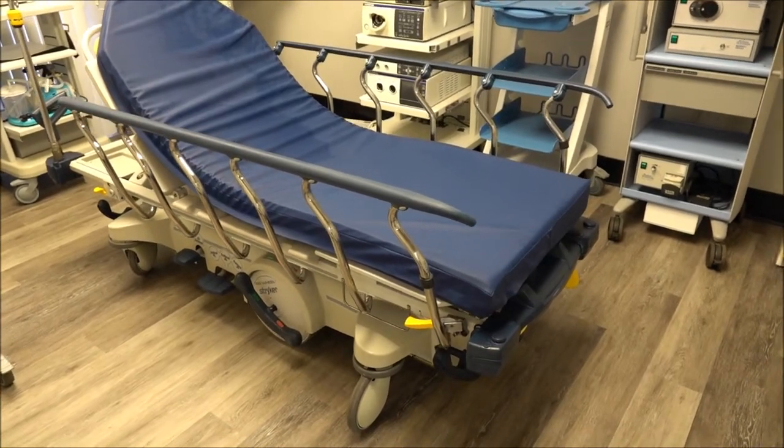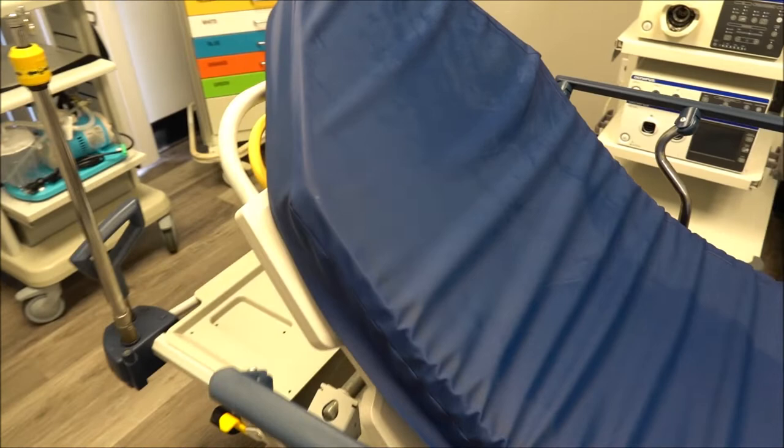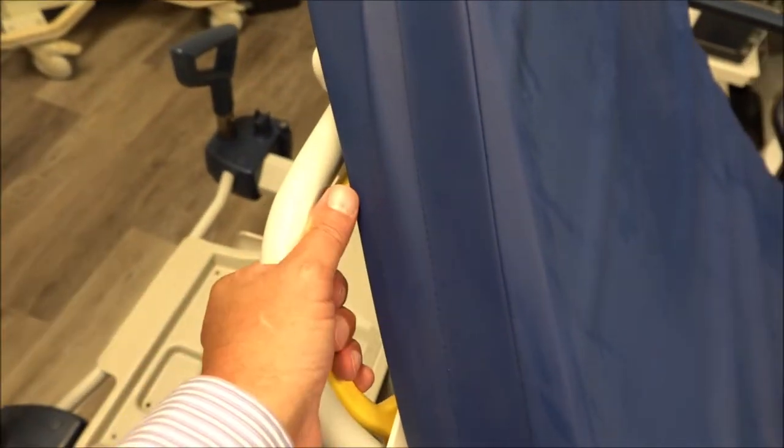We'll go through some of the basic features. With this particular stretcher, you have head adjustment, which is just clamping in right here. You can lower the stretcher down, flatten it out, or very easily lift it right back up again, depending on what the needs are.